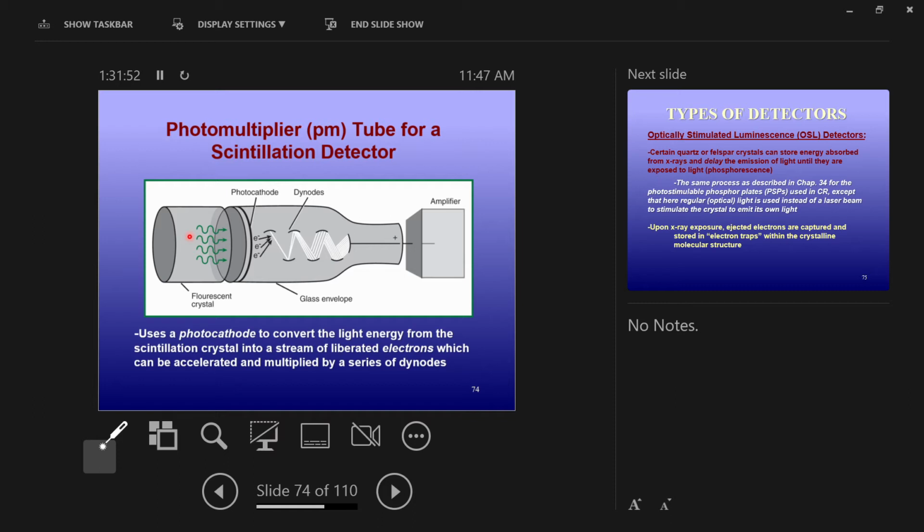An X-ray beam carries energy. In fact, X-rays are a form of what's called potential energy, okay? They move through space, but at a constant velocity with no mass and no charge, and all they carry is the potential to deposit energy into something, okay? So an X-ray photon comes along, and it strikes the fluorescent crystal. It takes all of its potential energy and it dumps it into the atoms in that crystal.